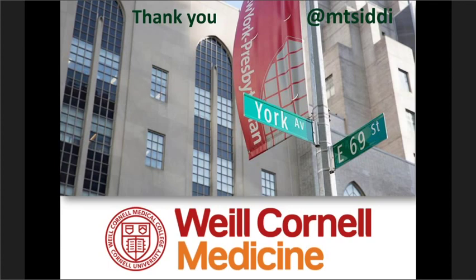Just a corollary to that, for the cystic lesions, they typically don't do a rapid on-site evaluation. But if they do, there probably aren't any guidelines for the number of cells or the mucin in the background, correct? That will be correct, Guliz. I think if you have thick gelatinous mucin on gross evaluation and on Diff-Quik sampling or staining, then that would be a consideration for calling it adequate.